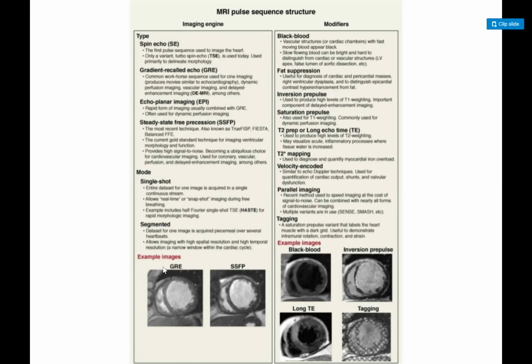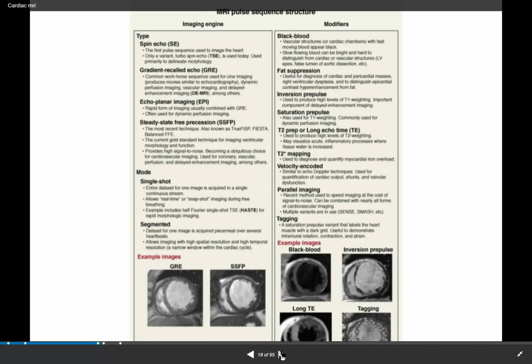And SSFP is really good for trabeculations. For example, this, I'm blanking a lot of things out after this COVID. The non-compaction. Non-compaction. You got it right. There's telepathy going on. So yes, non-compaction. It's really good for those.